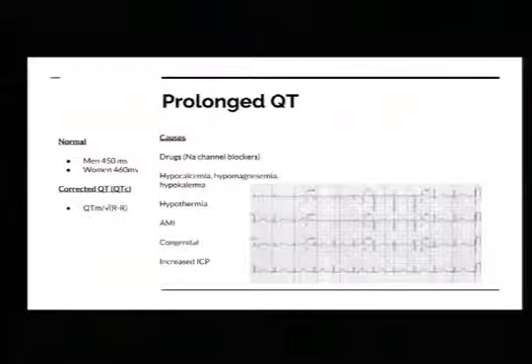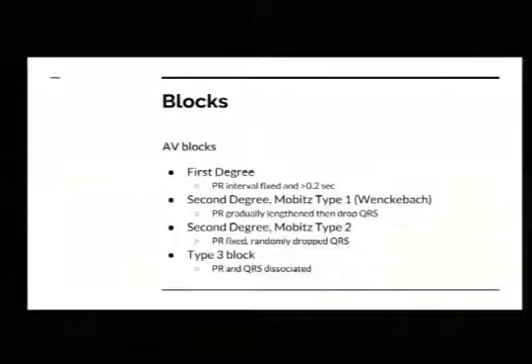That's the whole theory of why we need to do 12 leads for athletes, and ask do they have a family history of sudden cardiac death. And you can actually get this from a neuro response from a head trauma, head bleed, anything that increases the intracranial pressure. Women have a little bit longer QT interval, so 450 to 460 milliseconds. And the computer will correct it for you, too. You don't have to learn that.